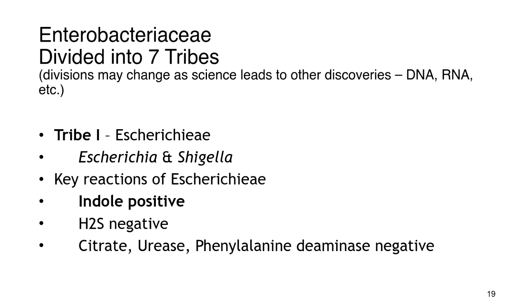But that's why we went through all the material we did last week, to give you an idea about when you see something that says indole positive, what does it mean? It means a certain test was done. And again, hydrogen sulfide negative, and we got a couple other things. So tribe 1, Escherichia and Shigella, and they're indole positive. That's what I would write down.